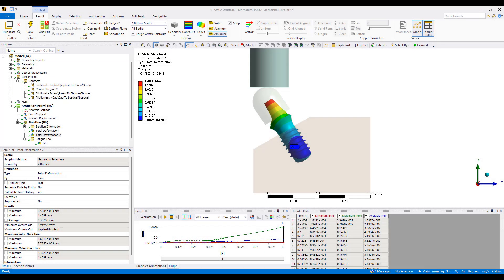Hi everyone, this is Ming Yao from Ozen Engineering. In this video I will be talking about how we set up a fatigue simulation for a dental implant.